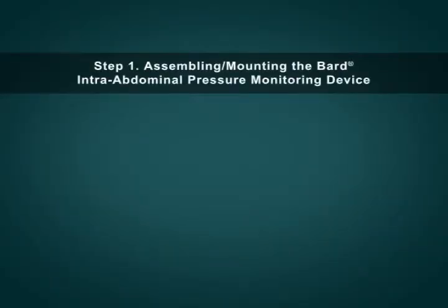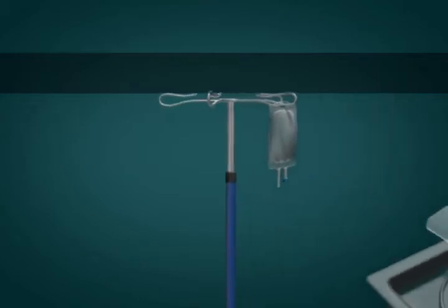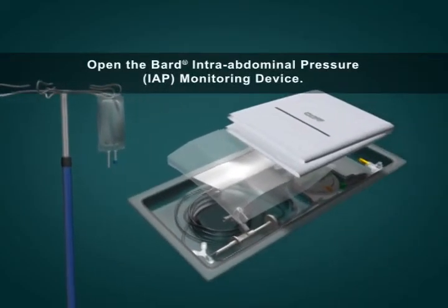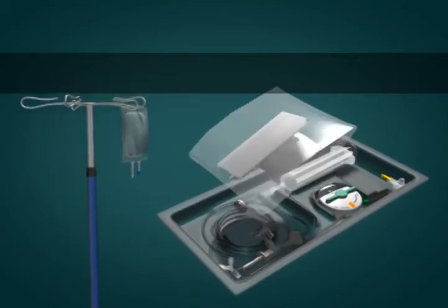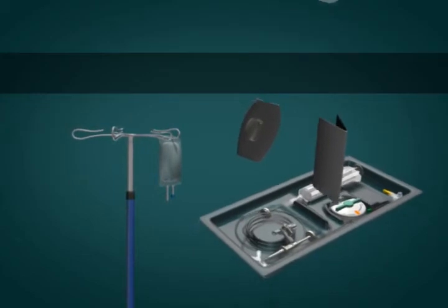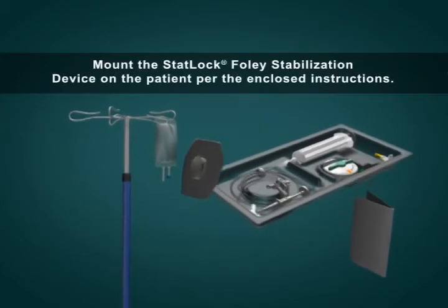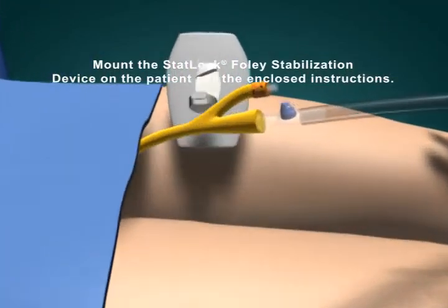Step 1: Assembling and mounting the Bard intra-abdominal pressure monitoring device. Hang a bag of sterile saline on an IV pole — a pressure cuff is not required. Open the Bard intra-abdominal pressure monitoring device tray and don gloves. Mount the StatLock Foley stabilization device on the patient per the enclosed instructions.